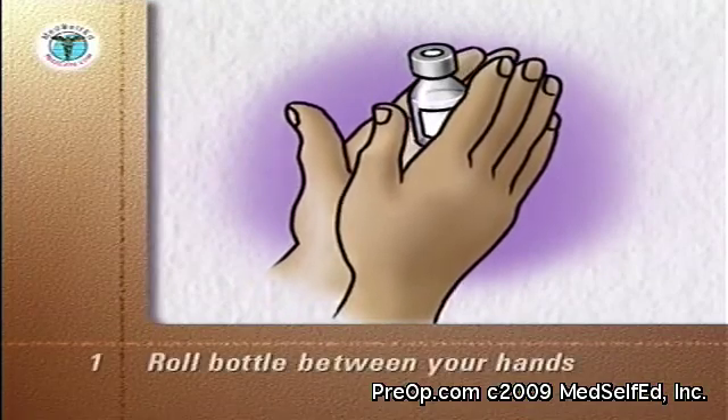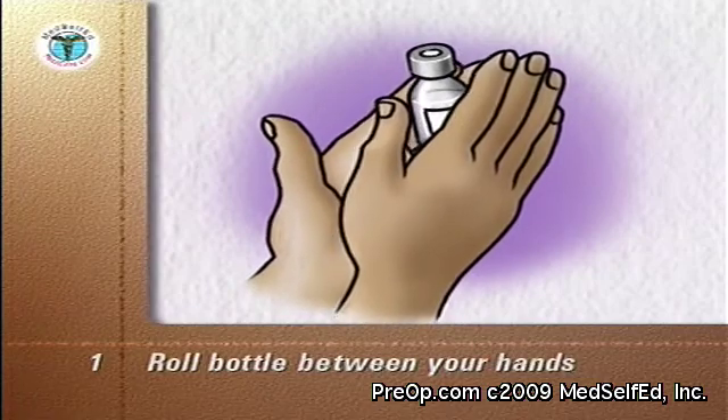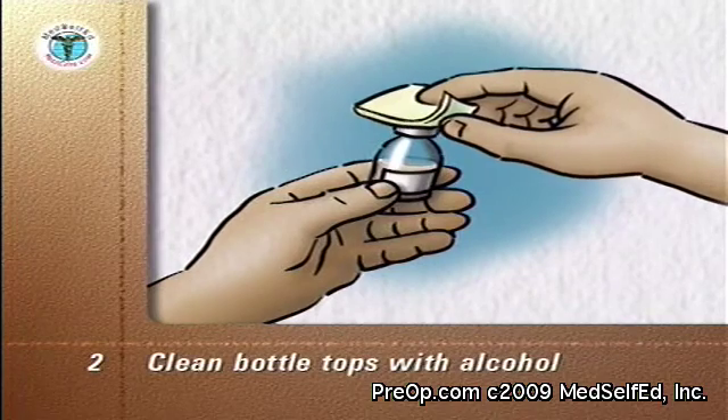Roll the bottle of the cloudy insulin between your hands to mix it. Then clean both bottle tops with an alcohol wipe.